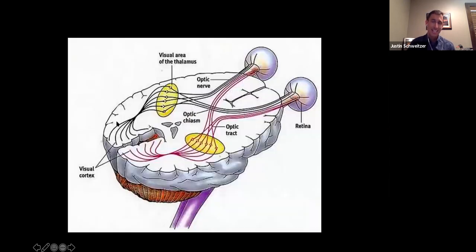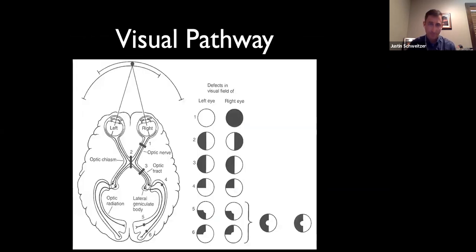So I definitely don't want to get too complicated with this. This gets into more of the neurological component of things. And this is a challenge because glaucoma a lot of times will mask or look like something neurological. My take home from this section, when you're doing a visual field and you look at the printout and you're going to obviously have the doctor take a look at it, is if you see something that is bilateral and consistent, okay, you have to think neurological.